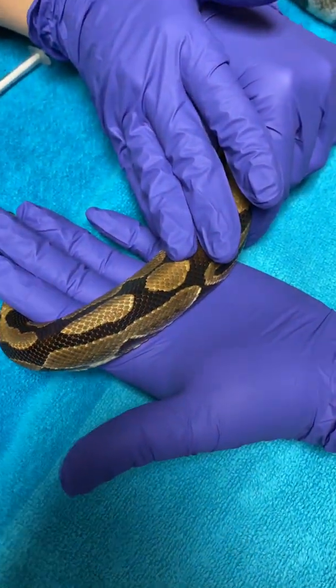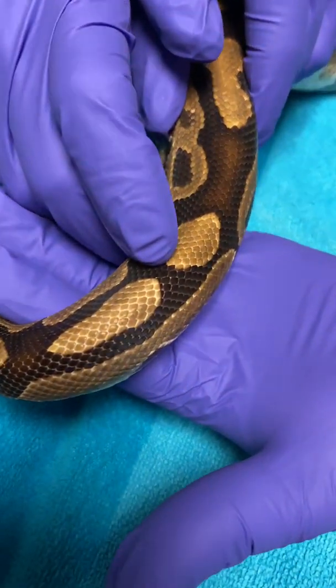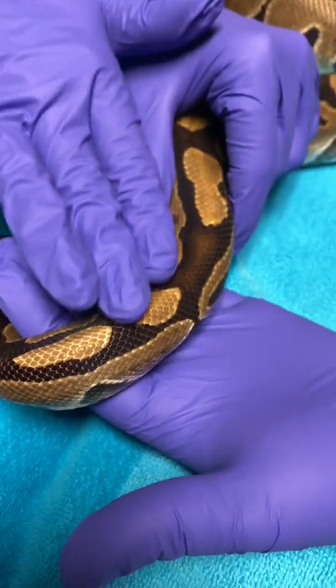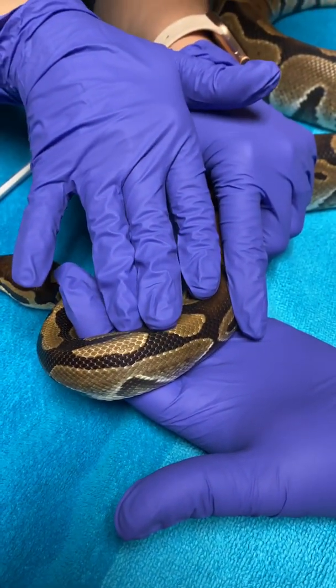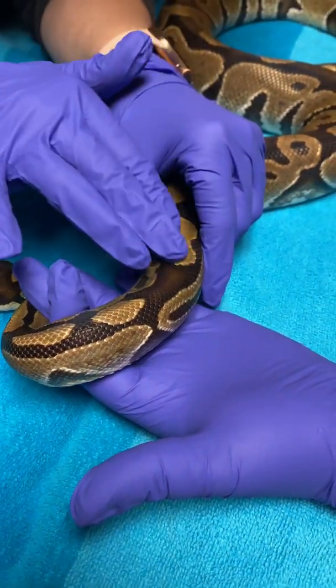When you give an injection, you're actually going to go in between the scales, not directly into a scale, but in between — I'm going to show you in just a second. When giving multiple injections, you want to make sure that you alternate sides so they don't get sore or tender.